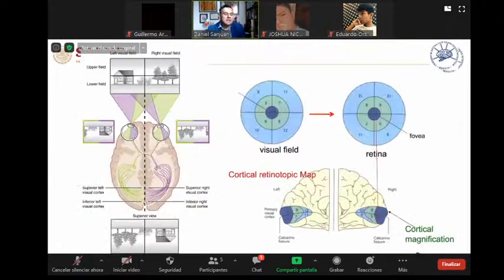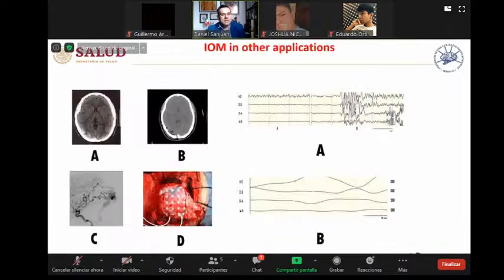There are other areas that it is possible to test, but they are more in the research field now, though sometimes we use them in clinical settings. Like with this patient, using cortical stimulation, we are recording using a grid in the occipital areas to produce the visual evoked potential, and preserve and identify the V1 area to decide if the patient can have the lesion resected without postoperative injury of the cortical visual regions.